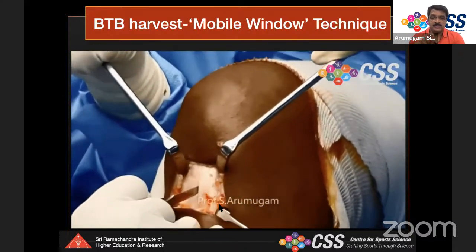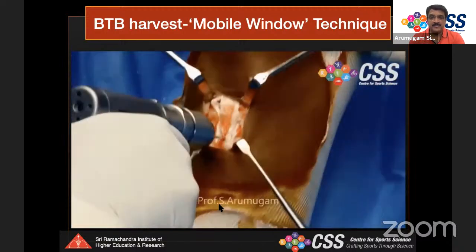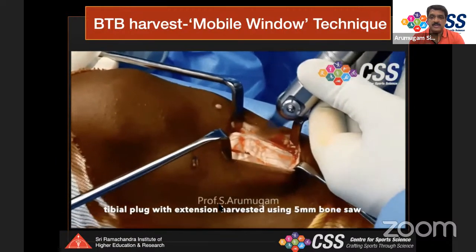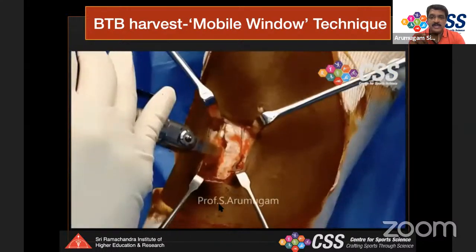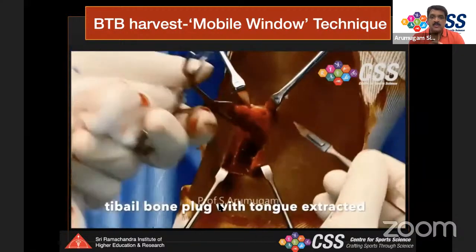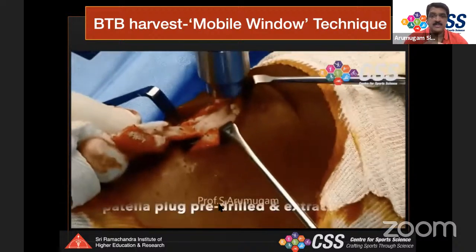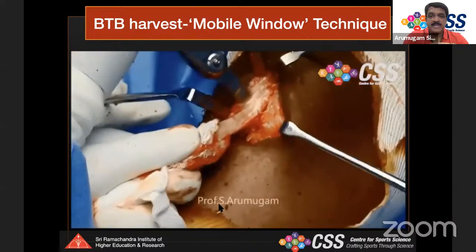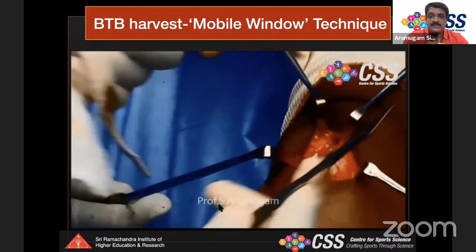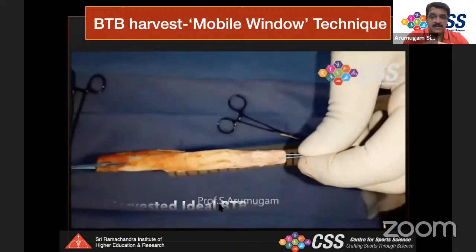In the video demonstration: the knee starts at 30 degrees of flexion; a skin hook is used to begin, the peritenon is carefully lifted and will be sutured back. The mobile window can move up and down. The incision on the patellar tendon is made at 110 degrees of flexion, then the knee is extended back to 30 degrees. The tibial bone plug is marked, three drill holes placed, then the motorized saw is used to deliver the tibial bone plug with the tongue. The mobile window is moved to the patella for full extension harvesting.